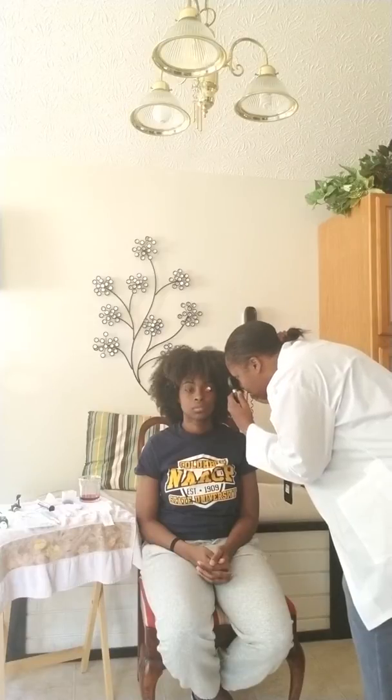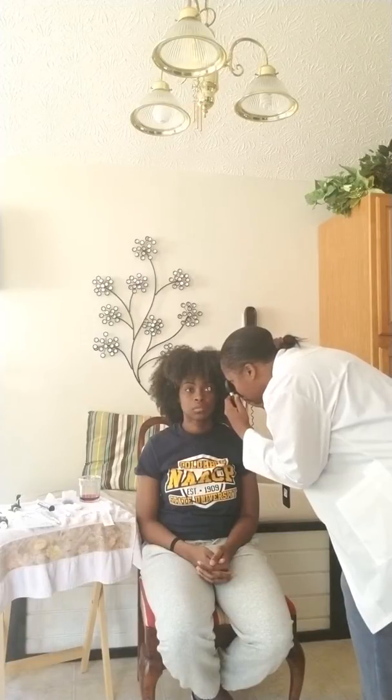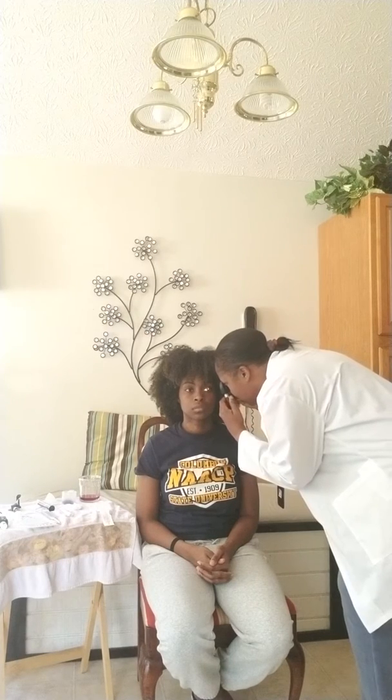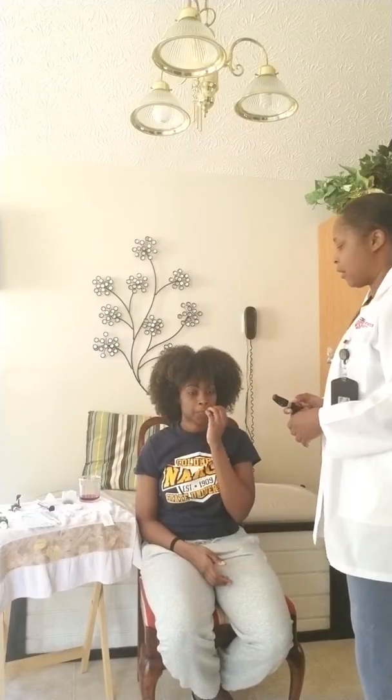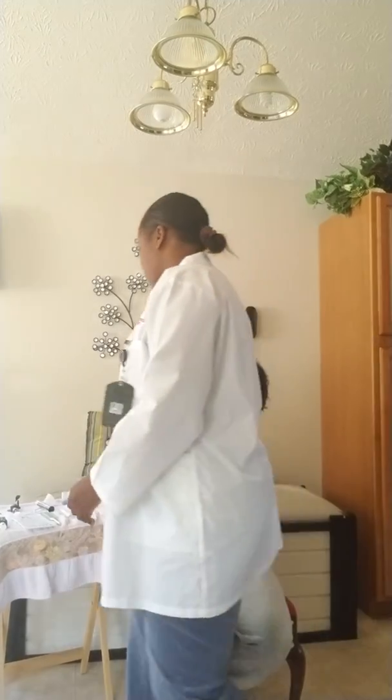I found hers. And you can actually see the color of her optic disc, which is yellow and orange looking, which is normal color. Okay, good. I didn't observe in either eye any cupping or any hemorrhages. Her eyes appear to be normal. Her optic disc and optic nerves are intact. Okay.